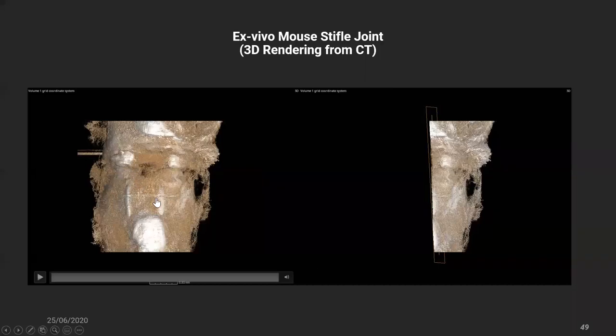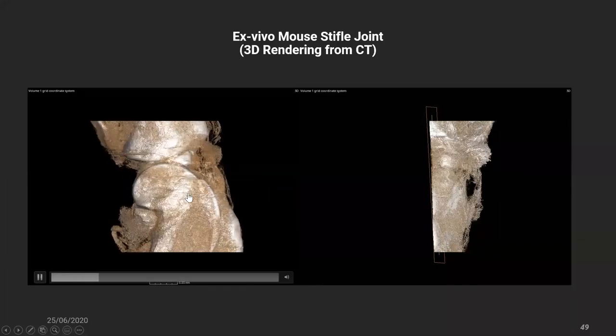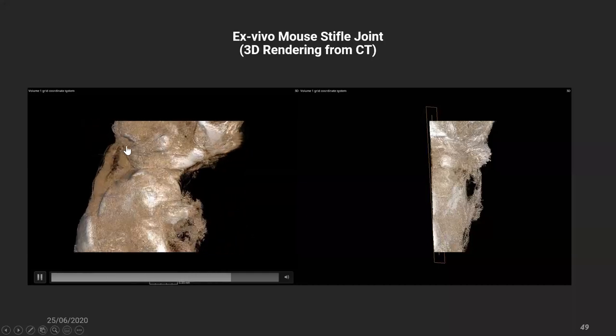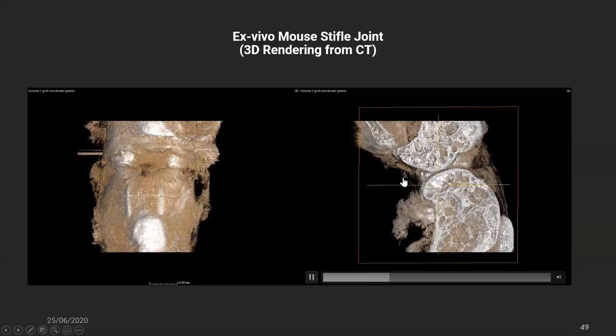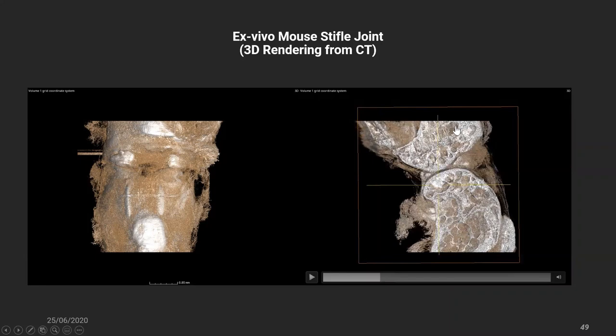This was a 3D reconstruction that we made of that same knee. Or I don't know if it was the same knee or another knee, but we took projections around the mouse's knee, so we were able to do this reconstruction. And then, of course, if you do reconstruction, you can do all sorts of interesting things. Like in this case, we were able to do cross sections and slices, so you could see, for example, the bone structure in great detail, along with what's happening here with the cartilage right there at the interface. It's neat. It's actually one of the first phase contrast CT images out there. You don't see many of these.